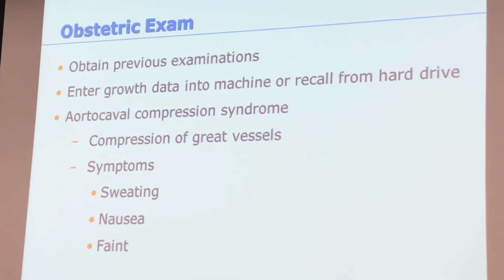Okay. My patient's laying there. I'm a new sonographer. And then I noticed my patient doing this. Okay, so what's happened, if you do that, immediately roll the patient to their left-hand side.